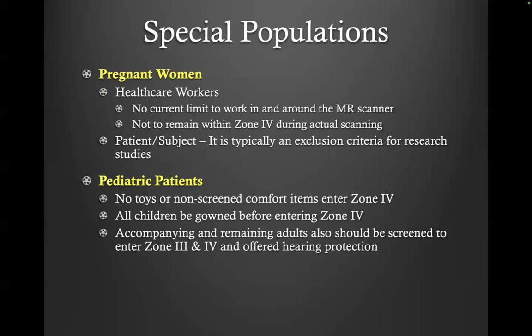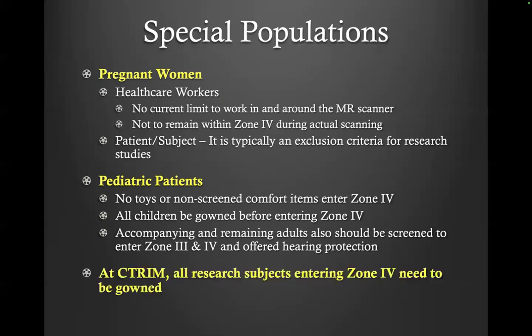For pediatric patients, no toys or non-MR screened comfort items may enter Zone 4. All accompanying adults should also be screened before they enter Zone 3 and Zone 4, and offered hearing protection. And at CTRIM, all research subjects entering Zone 4 will need to be gowned because we want to make sure there are no metallic things in their clothes and no remaining items in their pockets.